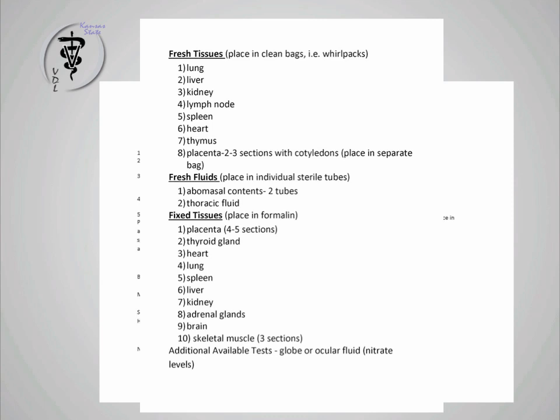And under the testing, it says currently we are validating TRIC PCR on abomasal fluid. So a lot of people think that Trichomonas can be an abortogenic agent, and there is really no good way to test for it. In other countries and at other universities, they're looking at this as well. So doing the routine Trichomonas PCR testing on abomasal fluid to try to identify that agent within the fetal tissues. It should be a validated test pretty soon. This time of year, we have a lot of samples to work with, so we're validating that as fast as we can.